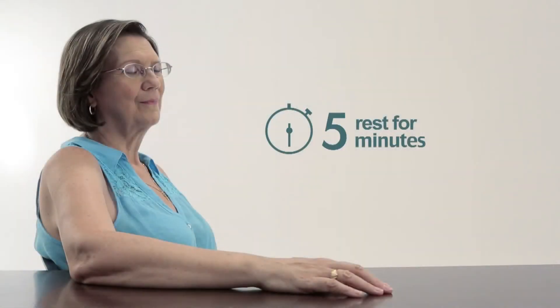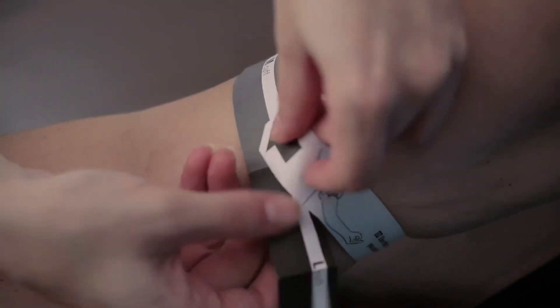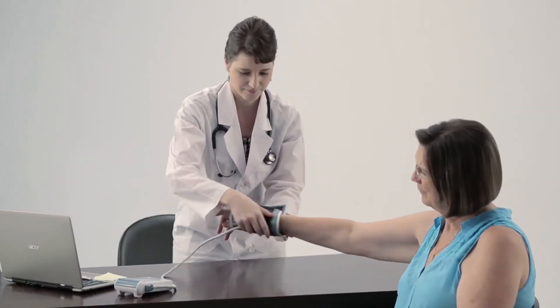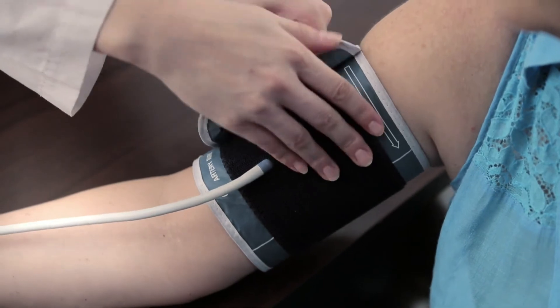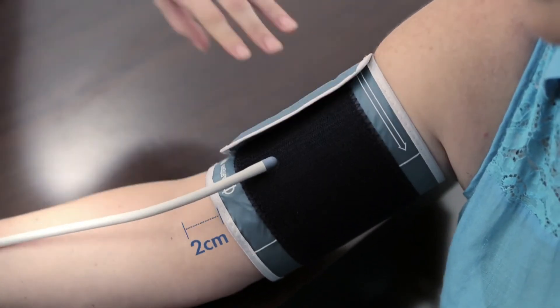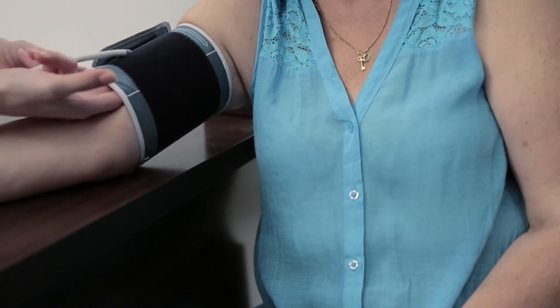Take five minutes rest before beginning blood pressure measurement. Choose the correct cuff size. Make sure the lower edge of the cuff is exactly two to three centimeters from the inner fold of your arm. The tube connecting the cuff to the device should be placed on the inside of the arm. Ensure that the cuff and arm is at the same height as your heart.